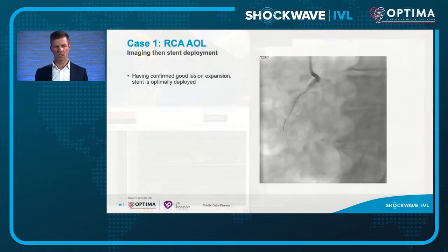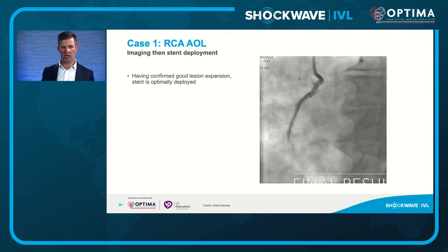Having confirmed good expansion with one-to-one non-compliant balloons, we deploy our stents and get a fantastic final result in this patient.